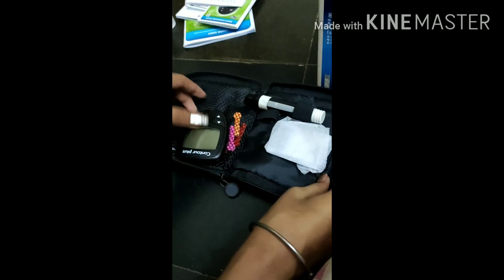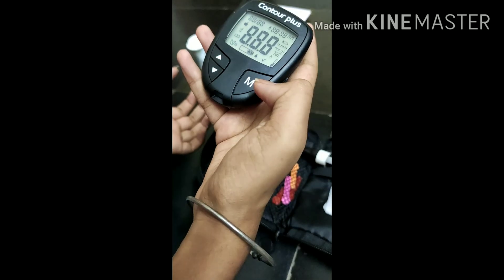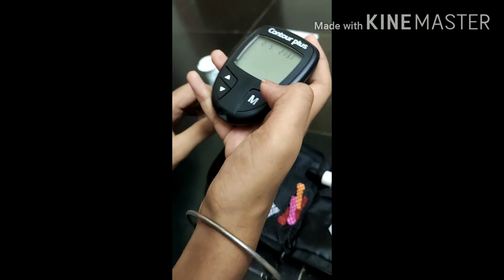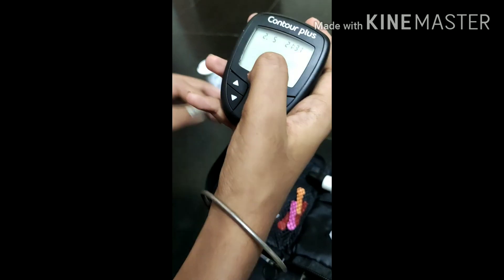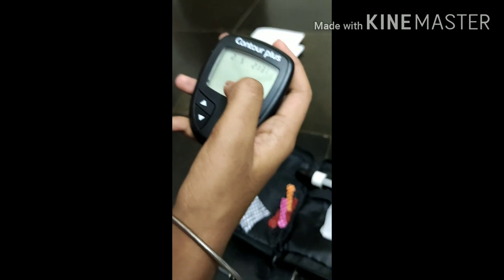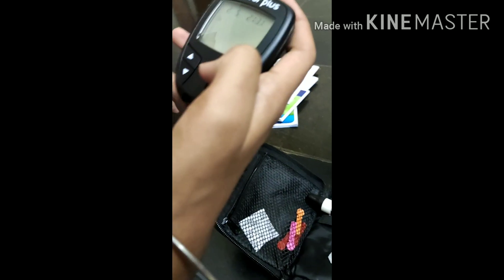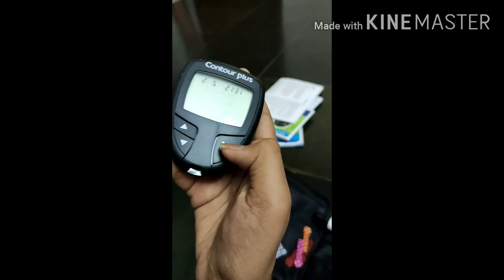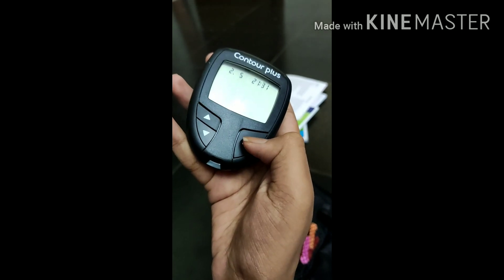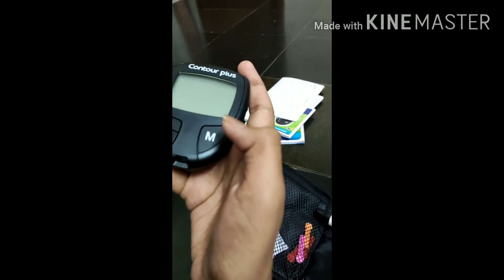When you use the machine, it should show a number. You can see it is asking you to insert the glucose test strip. Also, if you want to turn it off, you can click this button and it will automatically turn off.